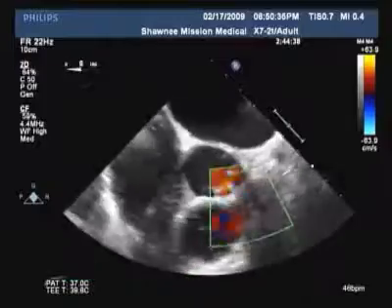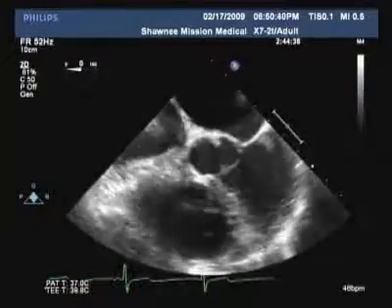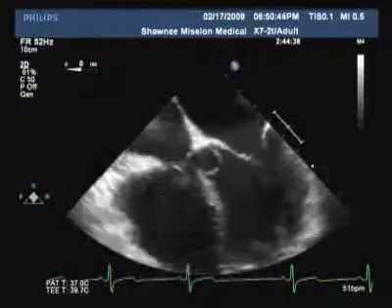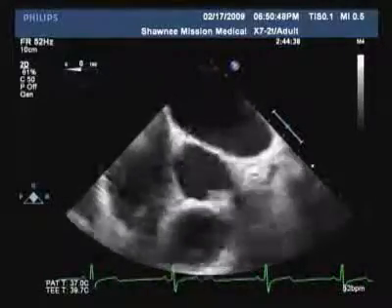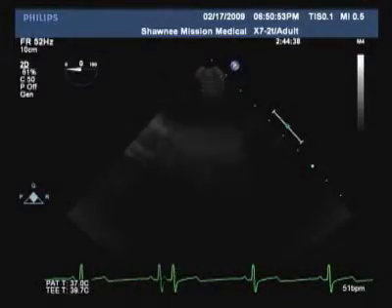I think, to me, you can take me off color. You'd call that a congenital valve, or it is. Born with it? It looks like a bicuspid valve that's congenital. Born with it is what that means. And actually, the aortic valve, bicuspid valve is the most common congenital anomaly we find that people are born with. Very common. And so not too unusual to see that here.